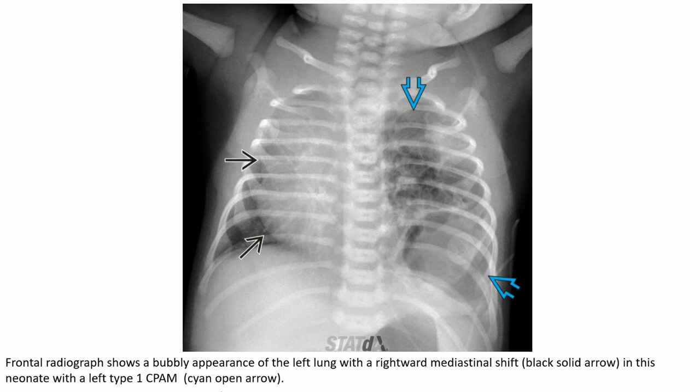Another case. Frontal radiograph shows a bubbly appearance of the left lung with mediastinum and heart shifted to the right. This case is a case of type 1 CPAM.